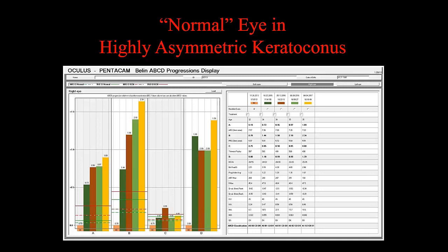So your old exams can be automatically analyzed. This is a patient that we went back and looked at. This patient has been followed for 4 years and ended up getting treated, but they already had mild decrease of vision.